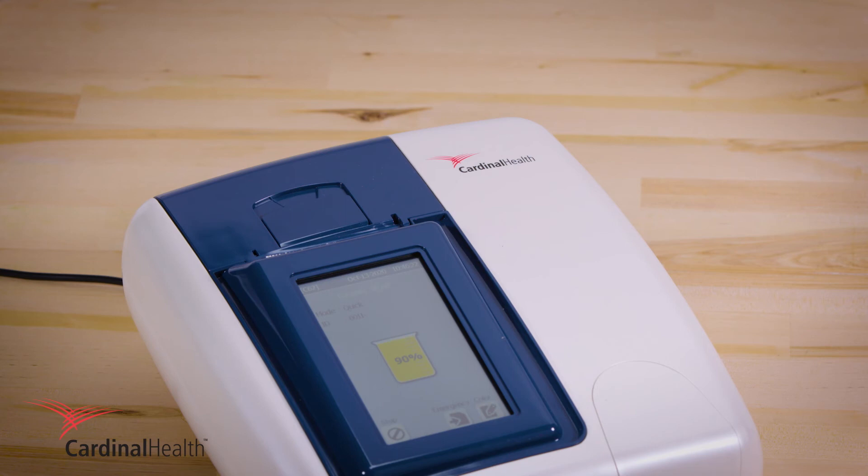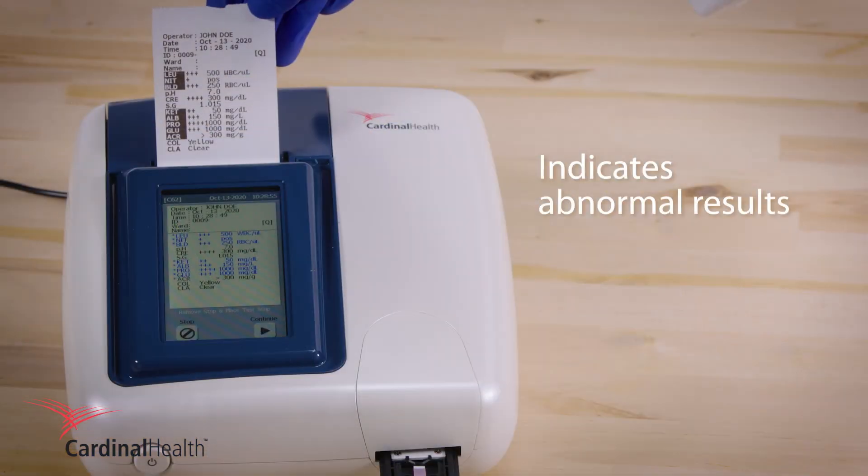After the color develops, place the strip on the strip holder for analysis in just 5 seconds. In either mode, abnormal results are highlighted both on screen and on paper.